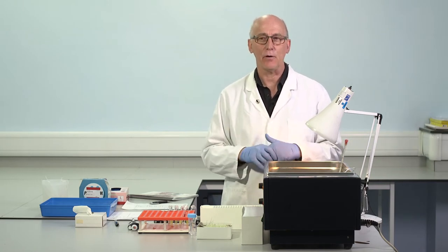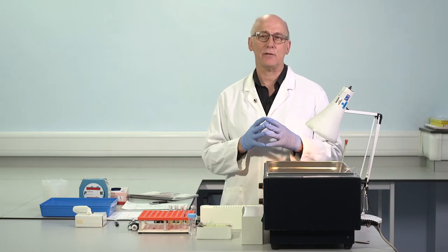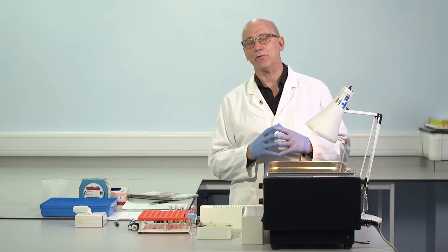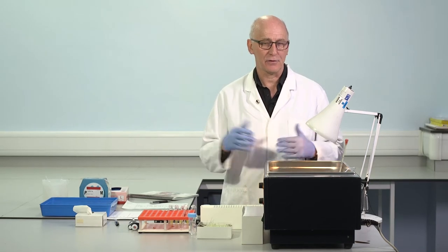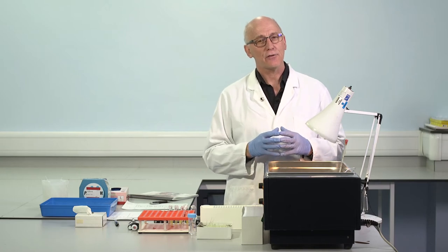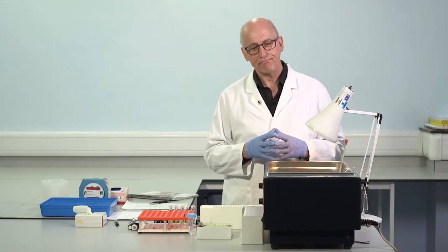I think two levels is adequate. But there should be levels with different results. We need a normal control, and that tells us that the method is under control in an important area, that we're able to obtain good results in normal samples. But of course, some of the key samples that we'll be testing are patients with abnormalities. We're interested in particular, of course, in bleeding disorders. So we want to be confident that our method is also working well when we're dealing with prolonged APTTs. So I think the second level of control should be effectively an abnormal in a critical area. So we've got some degree of prolongation.